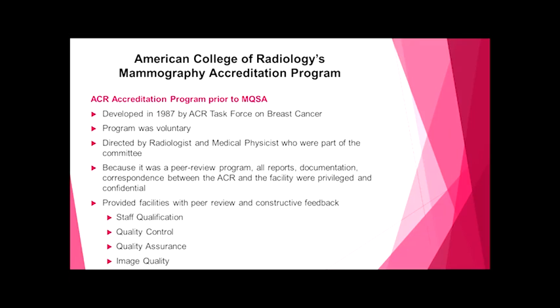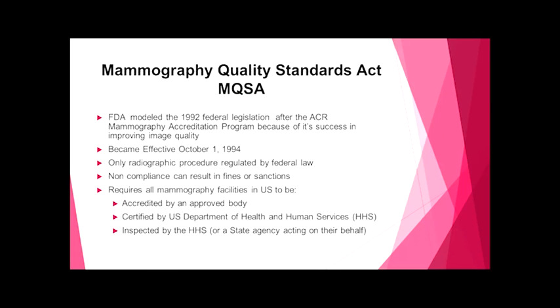This initial ACR accreditation MAP program provided facilities with peer review and constructive feedback when it came to staff qualifications, quality control, quality assurance, and ultimately image quality. And it's interesting, because when the FDA began to talk about implementing mammography quality standards, they modeled it after the ACR program.